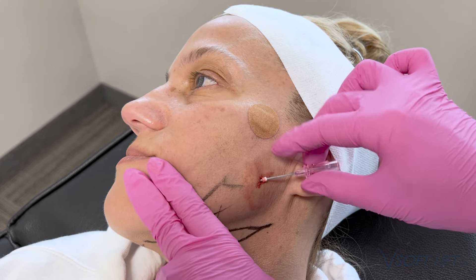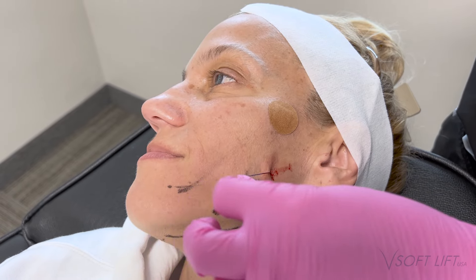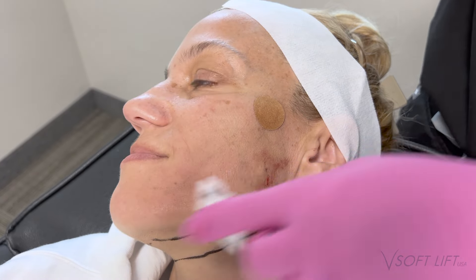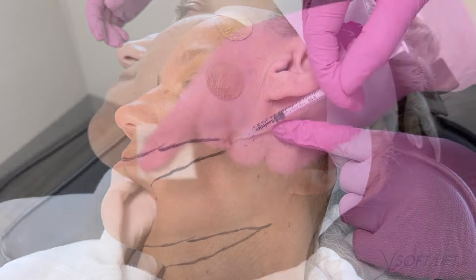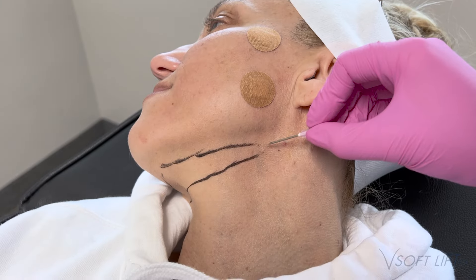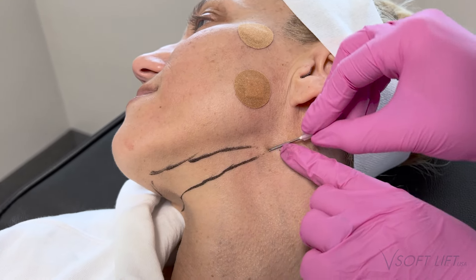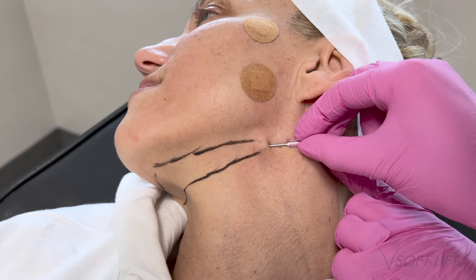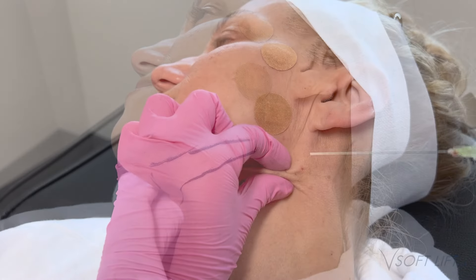This patient is amazing — she literally didn't flinch throughout the whole procedure. She's not new to cosmetic treatment, so this was very comfortable for her. Going in with our fourth thread for this side, going all the way past the area of animation to reduce the risk of thread visibility during animation. I give it a gentle little tug to make sure everything is engaged, then go ahead and cut with sterile scissors.